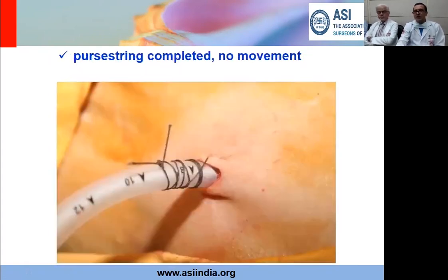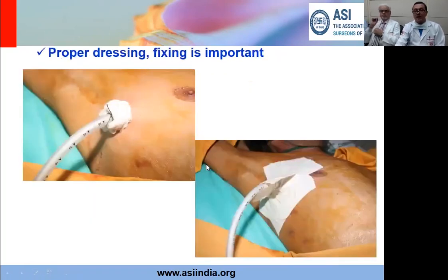So once you've done that, you take the suture around the tube to keep it anchored, and finally you put this knot here. So now you have your chest tube adequately anchored to the skin and not in a position to come out. The next step is to put a sterile dressing around it. Now remember, this is a sterile area, and if you put a dressing like plaster, Dynaplast, whatever, directly, those are not sterile things. So you have to be careful that you put a sterile dressing around it.